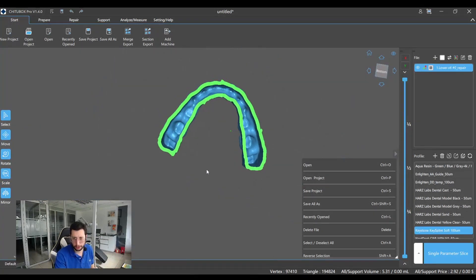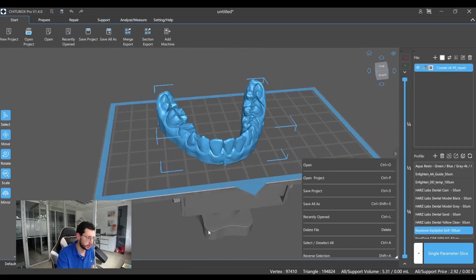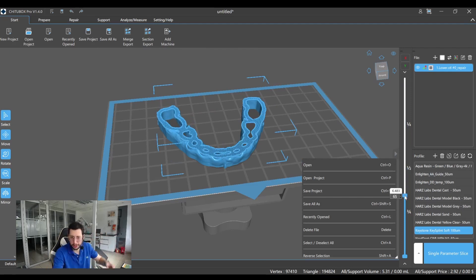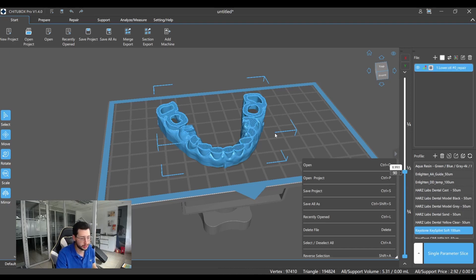Although this can be enough for most cases, I do recommend using supports, because as you can see, when the model increases in height, the walls converge to the middle. So sometimes those walls can be weak or don't have enough support.